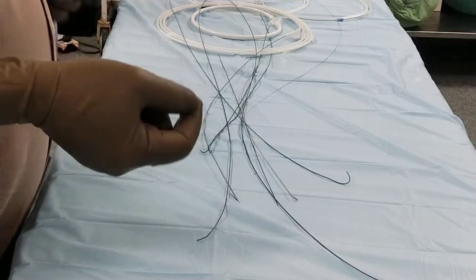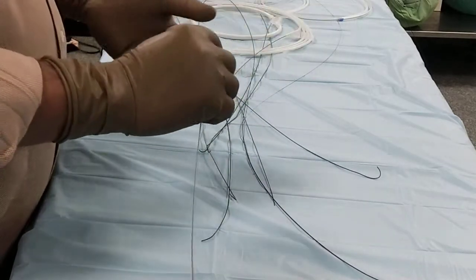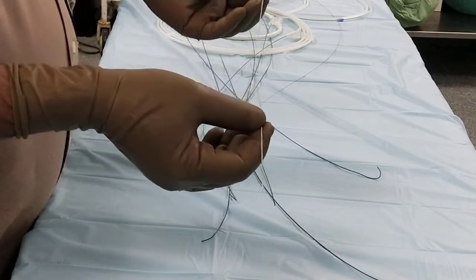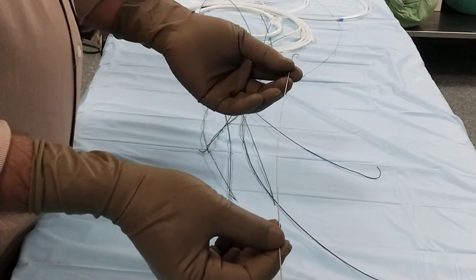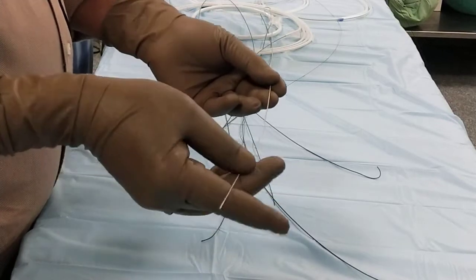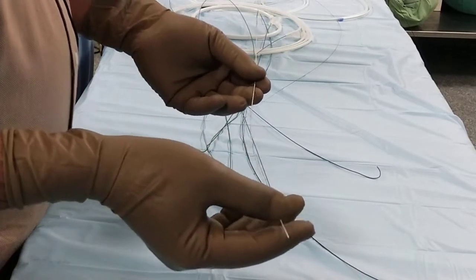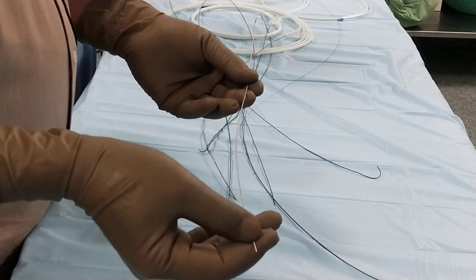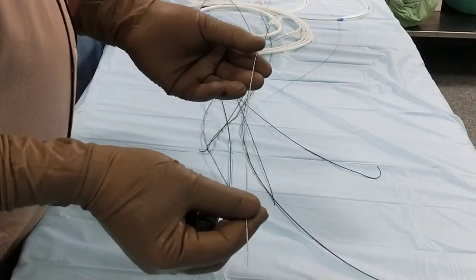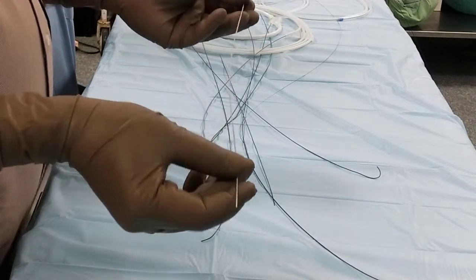When you use a needle and puncture the artery, we need an initial guide wire so that we will have access through the guide wire. This is the access guide wire. Guide wires are measured in inches — not in mm or French. The length of this initial access guide wire is around 30 centimeters.